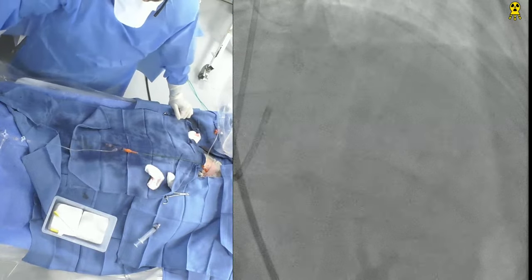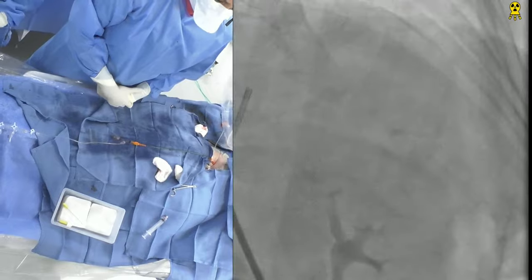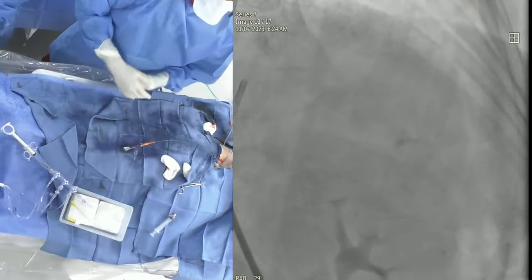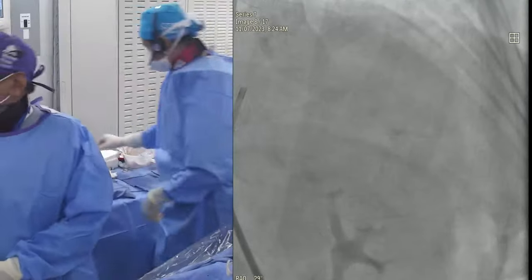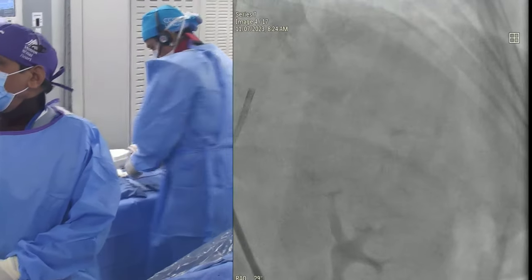I mean, not much calcification, is there? Yeah, there is. It's actually proximal. You're right. There is. At the lesion, probably not. It's proximal only. See that? So moderate calcium proximally, but definitely not at the lesion. We're seeing it a little better now. There's not much in the LAD diagonal system.